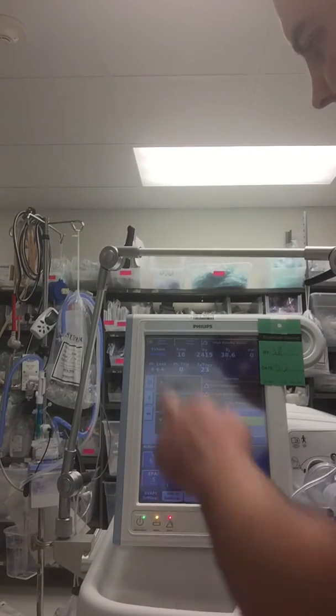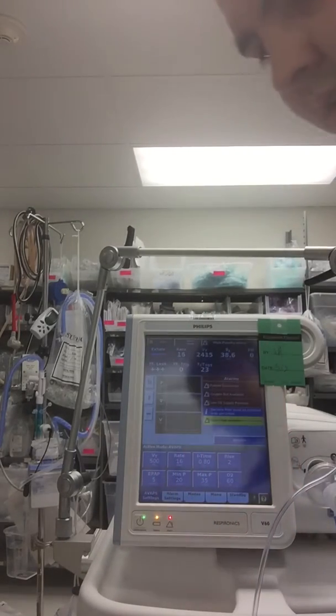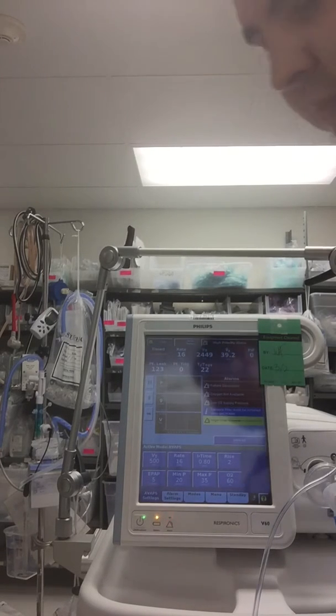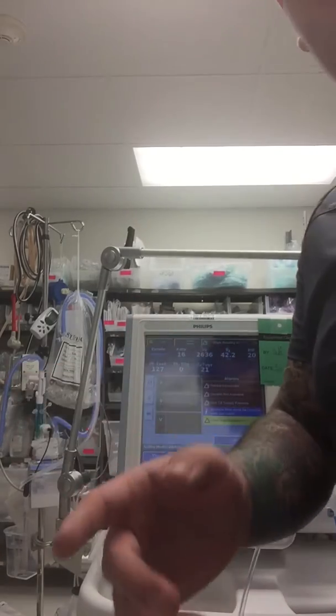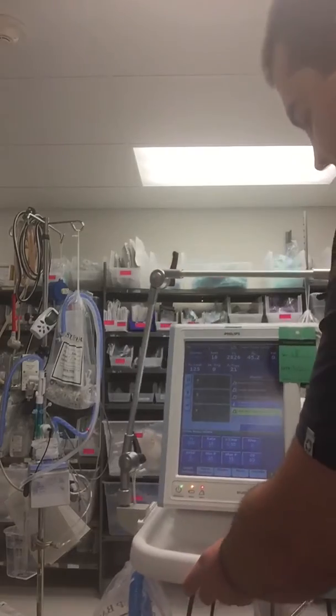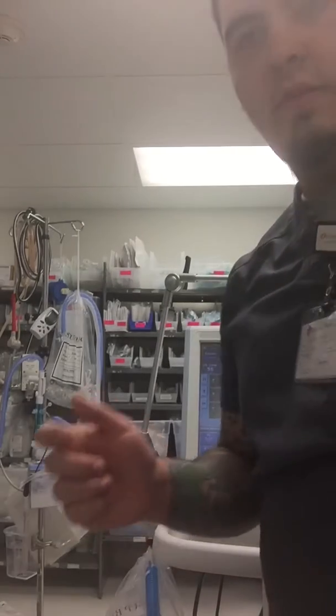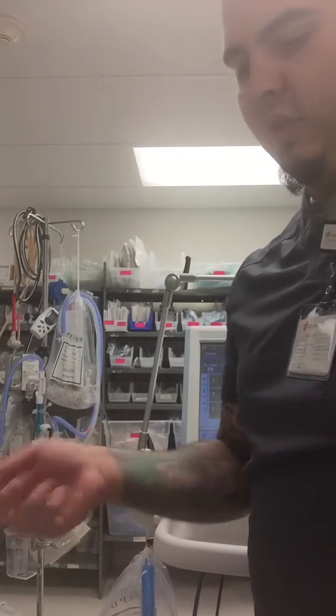And then in terms of oral cares, they're intubated. I don't have any of the swab, the suction kit.